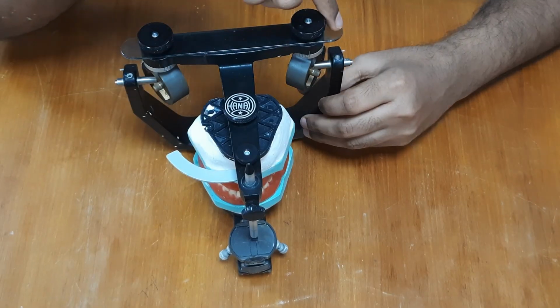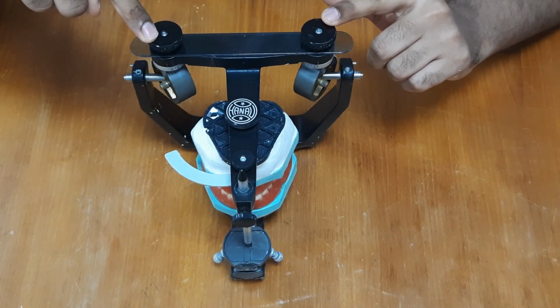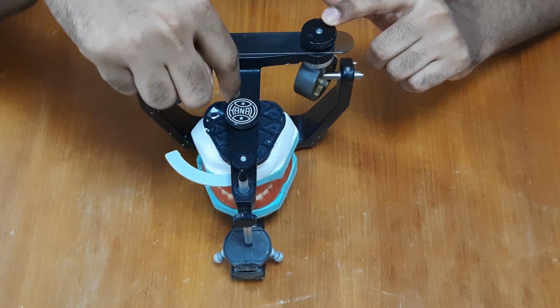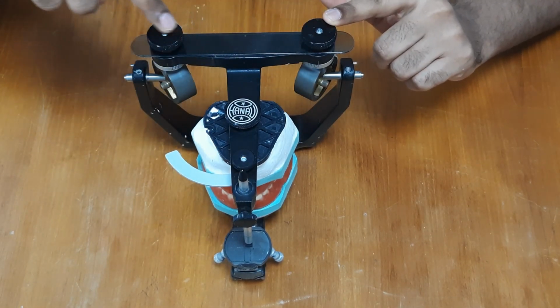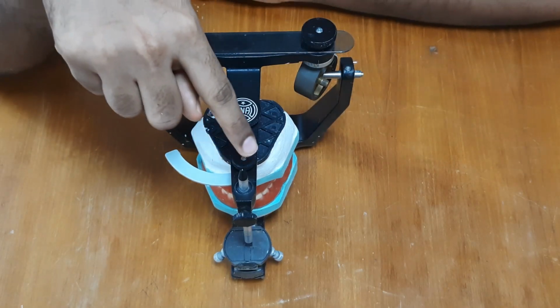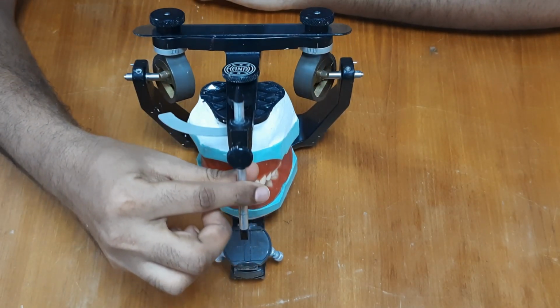This is the upper member. It is T-shaped. One arm runs anterior-posteriorly, the other arm runs transversely. The anterior end of the vertical arm has a provision to accept the incisal pin.